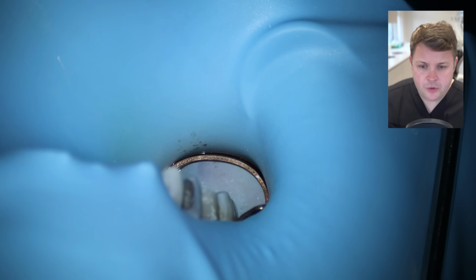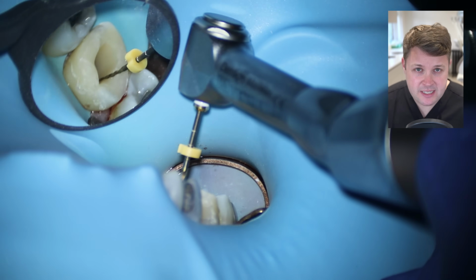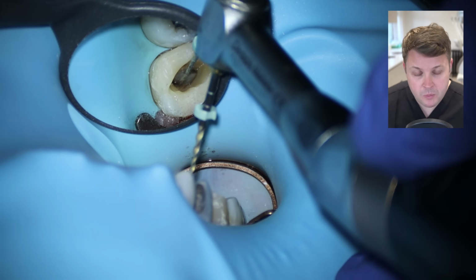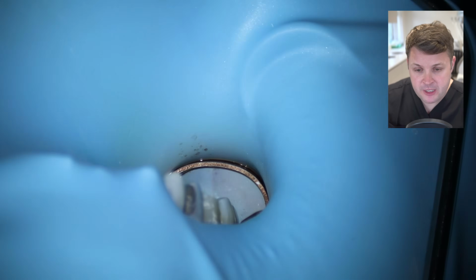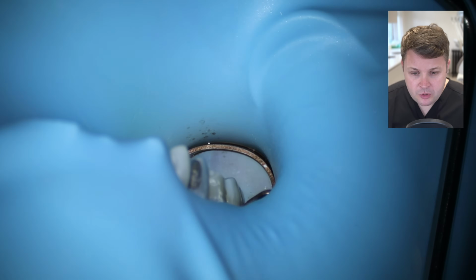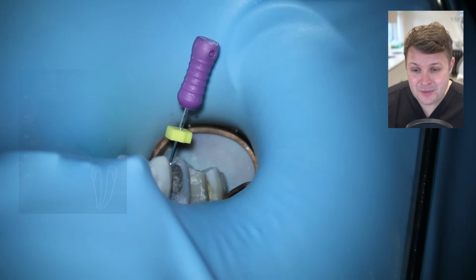So because I'm struggling slightly, I can feel a little bit of resistance with the DB. I'm obviously going to use my glide path file at 0, but I'm going to use a size 20 HyFlex here. And this is a nice step up between the 15 to the 25, because it's quite a big step. But the DB, although we found it difficult to find, was shaped quite easily.